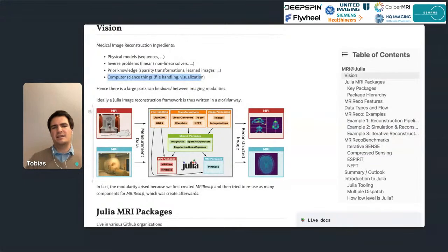But there again, the point is how you post-process a reconstructed image. There is the entire family of image processing tools that is usually not specific for a certain modality, so it makes sense to split this off. This is the vision of why things are developed like they are, and how I present them in the next minutes.